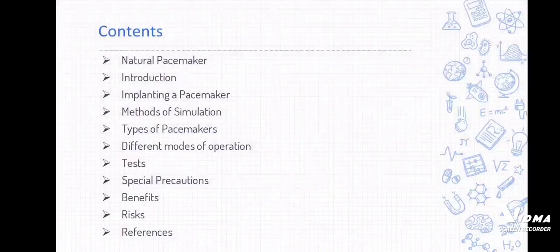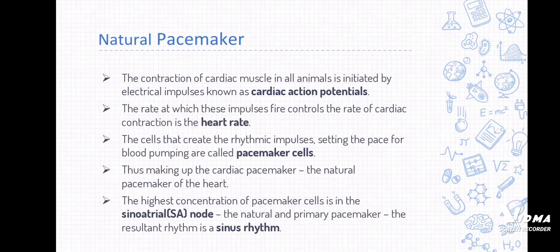Contents: the working of the natural pacemaker, implanting a pacemaker, the tests, special precautions, and the benefits and risks related to the pacemaker. Natural pacemaker.